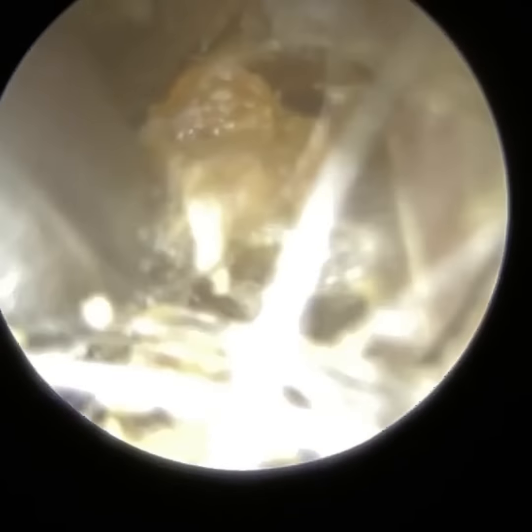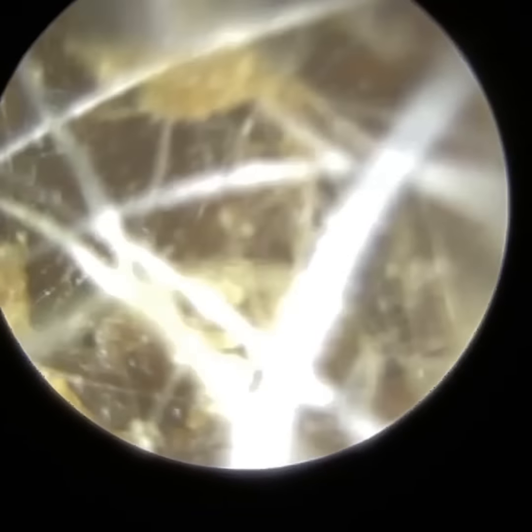So this is the patient's right ear. You can see at the entrance the patient's got loads of hairs. Now these hairs should only be found on the outer third of the ear canal. If you think about the ear canal in thirds, the outer third is cartilaginous, lined with a thick layer of skin about 1 millimeter in thickness, and the cartilaginous portion of the ear canal also contains these hair strands.